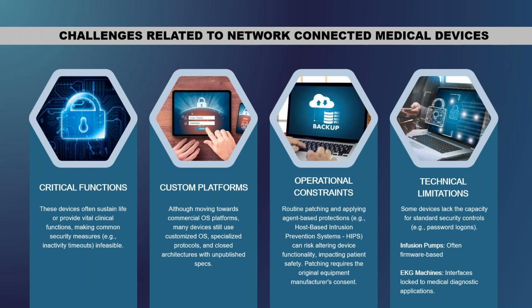Whenever we had PrintNightmare, WannaCry, all those, it was a mad scramble to talk to all the manufacturers and make sure that we could put that patch onto the system as soon as possible without impacting any patient care. So, those are the operational constraints.